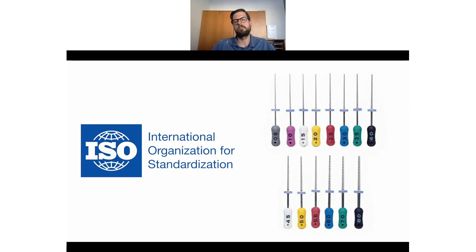You know the ISO sign is the International Organization for Standardization, and we all know that the files in endo are ISO. So it doesn't matter if you buy a 10 K file from one company or from another, the size will always be the same. And it is a shame that many other things in dentistry are not ISO. So this is a good thing, and everybody who is working should have an ISO standard.